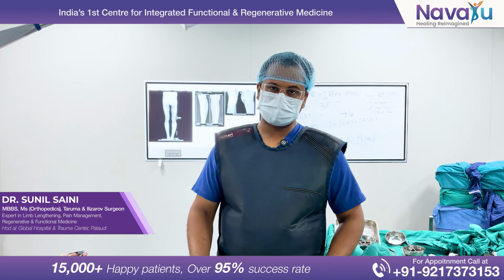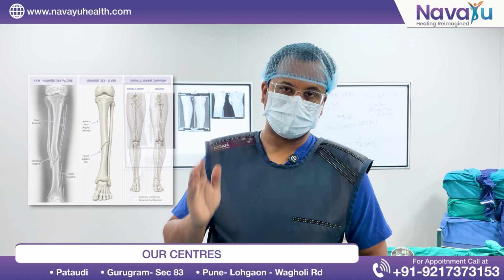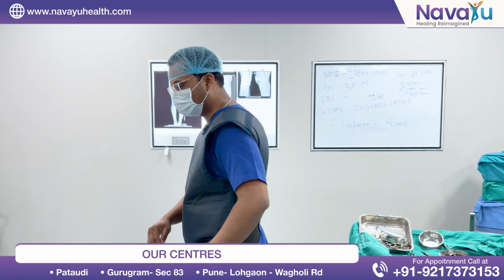We have another case who is basically a case of malunited fracture of both bones of the leg, in which there is deformity, that is a varus deformity, and there is a shortening of 2.2 centimeter. I can show you on the x-ray.